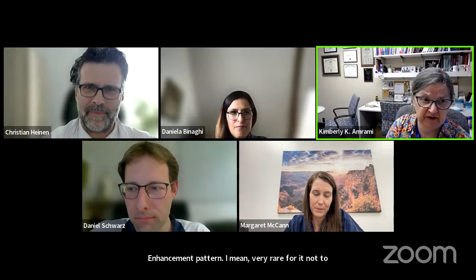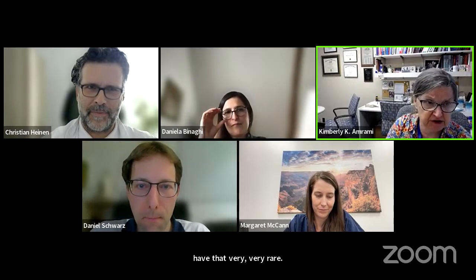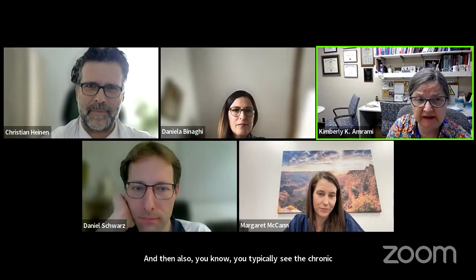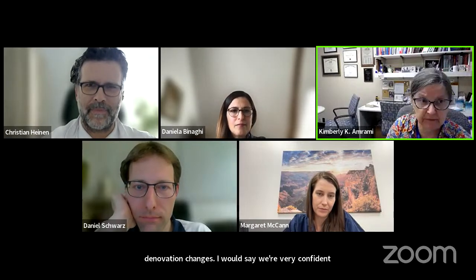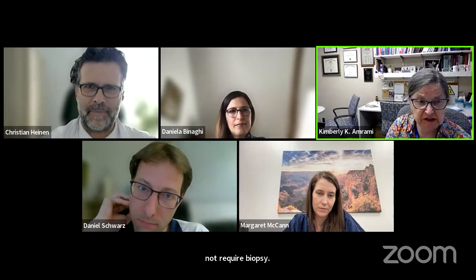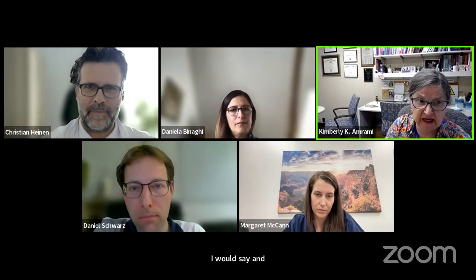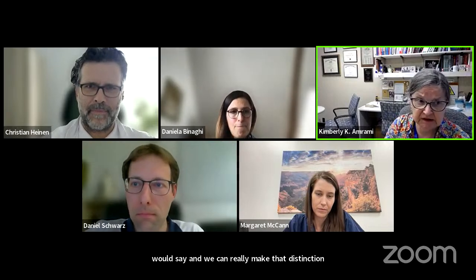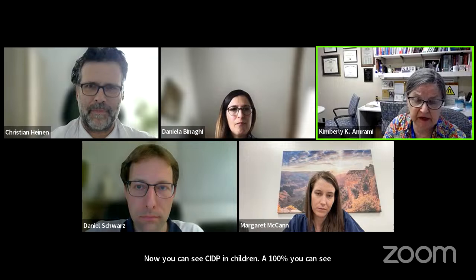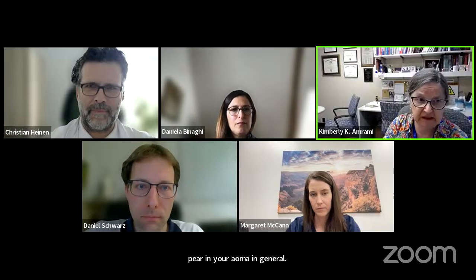I think perineurioma has such a characteristic enhancement pattern. It's very, very rare for it not to have that. And then also, you typically see the chronic denervation changes. So I would say we're very confident when we make the diagnosis of perineurioma that it does not require biopsy. And since there's rarely any real surgical intervention for that, usually those patients just get followed up. And we can really make that distinction. Now, you can see CIDP in children, 100%. So you do have to be careful. But perineurioma in general is so characteristic that it really does not require biopsy in most cases.